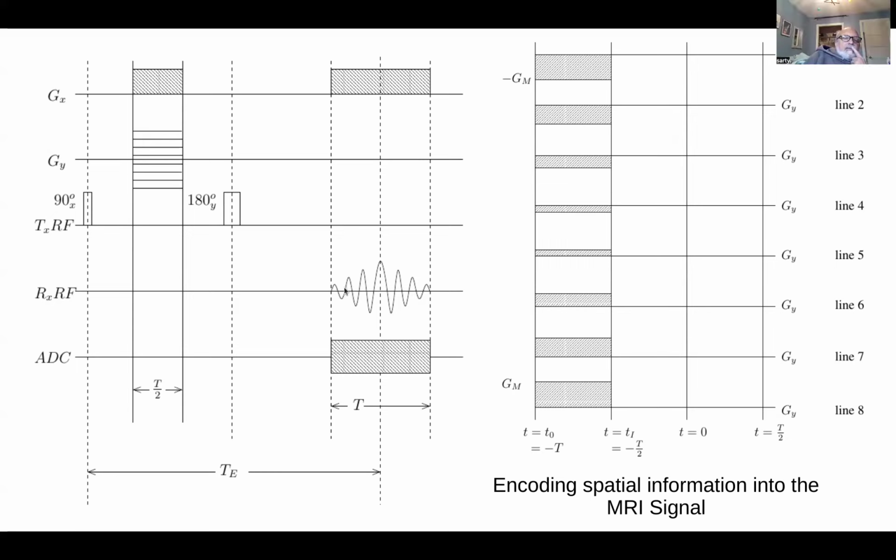Okay. First of all, this is a schematic. The signal that we're actually going to receive, after superheterodyne detection, is essentially the envelope of this if this is the Larmor frequency. In the rotating frame, all you're going to see is the envelope. So what you're going to see is a shape here that corresponds to the Fourier transform of your object in the x direction. Okay. So it's like it was modulated there, something like that.